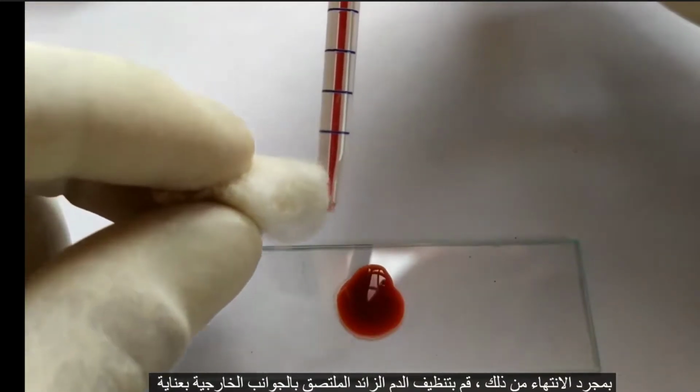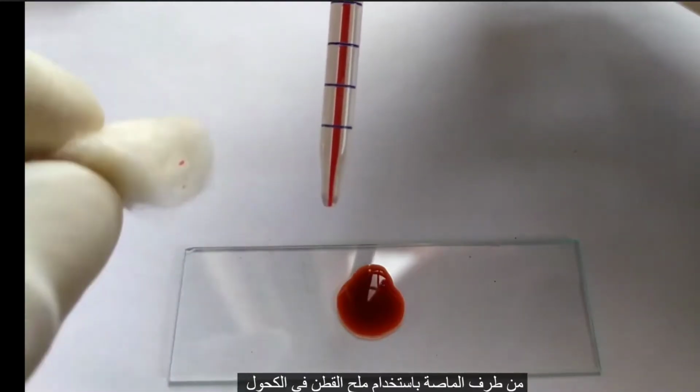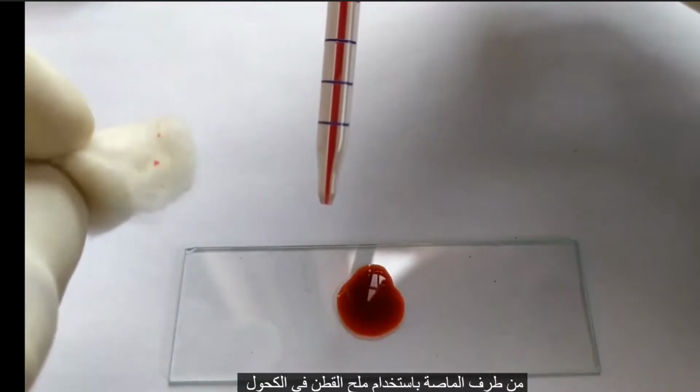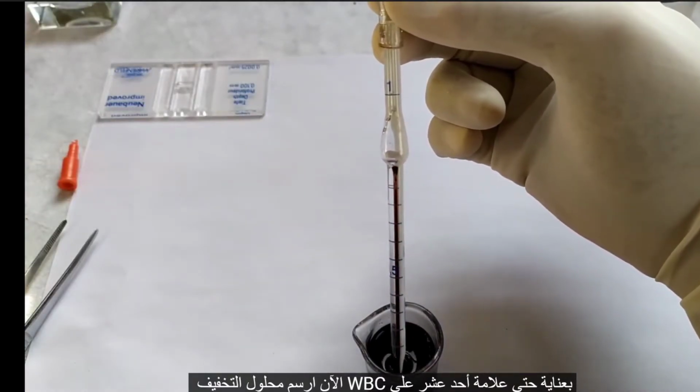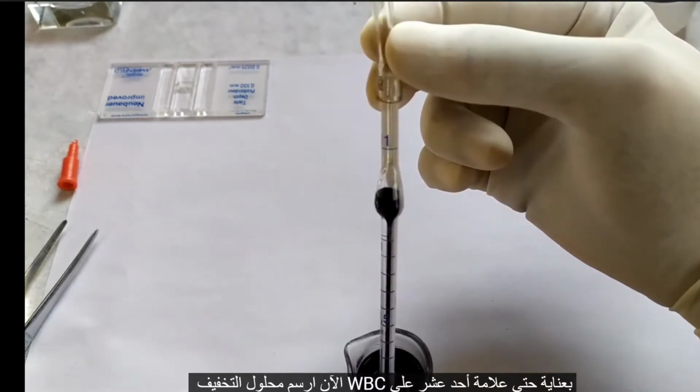Once that's done, carefully clean the excess blood sticking to the outer sides of the tip of the pipette using a cotton soaked in alcohol. Now carefully draw the WBC diluting solution up to the 11 mark on the pipette.